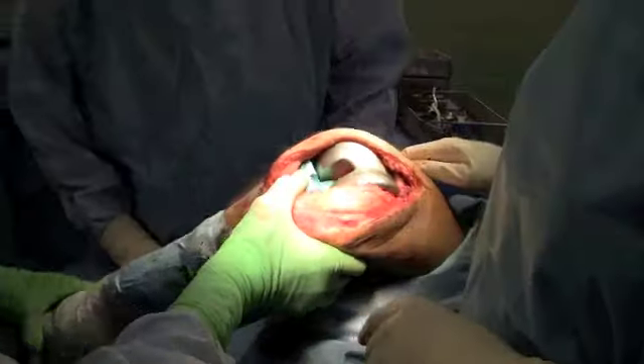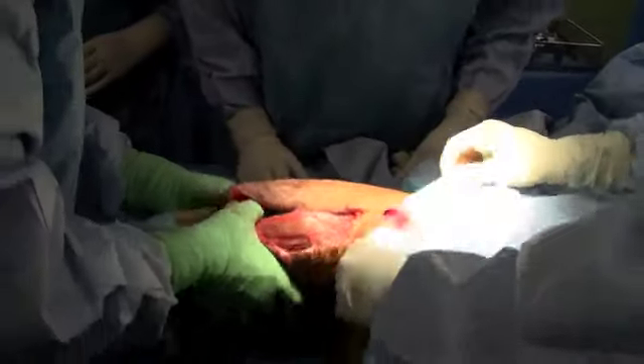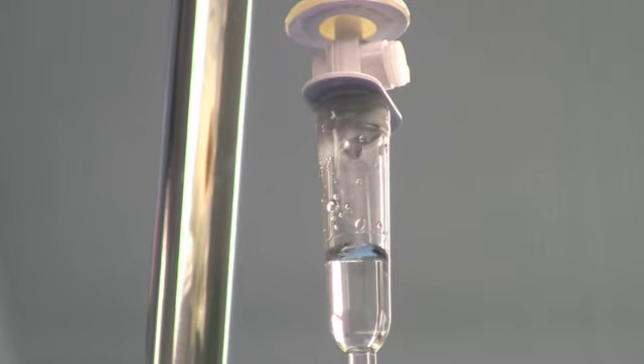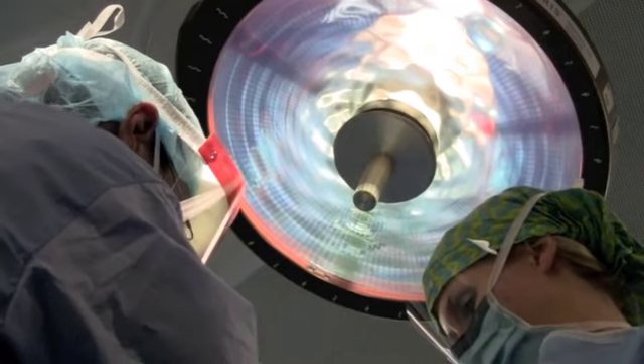A total knee replacement takes less than two hours to complete, and Dr. Golish and his colleagues perform more than 1,000 at the Holland Centre every year. An award-winning model of care there helps determine who is a candidate for surgery, who needs other forms of care like physiotherapy, and has also cut down on wait times.